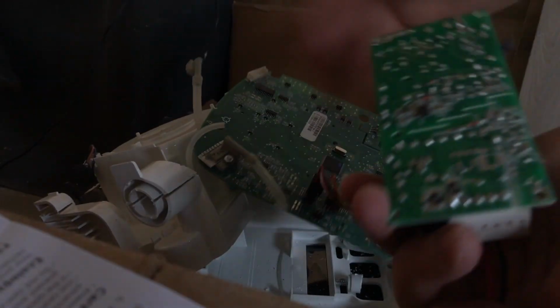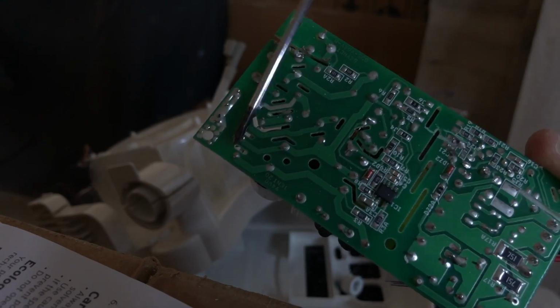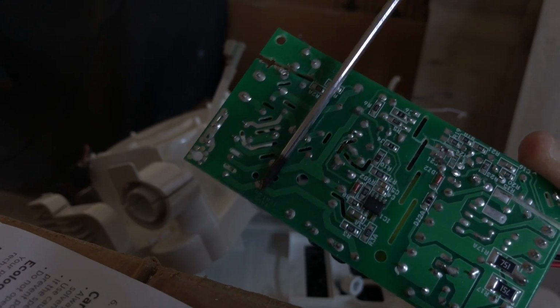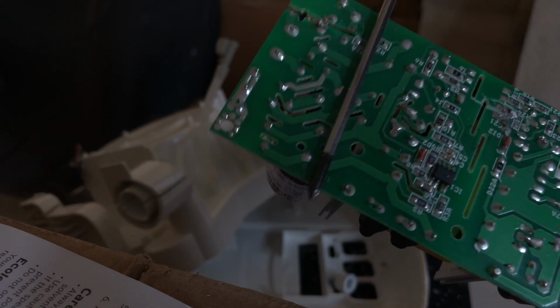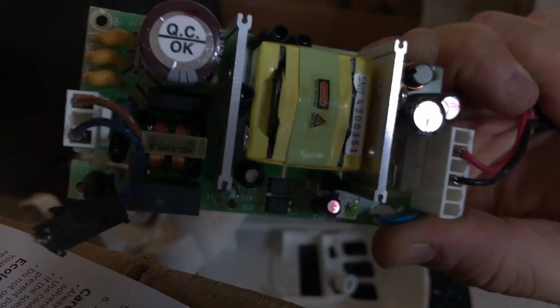And there's the power supply. So we've got our power supply on the bottom. Let's just unplug it from the main board here. There's our main power supply. That cap may still be charged. We can try to basically discharge it now. Let's see if it releases the electrons. Anything? That's the cap there. So looks like there's nothing there. There's some more here. Okay, we're good. Okay, so that's the main power supply.